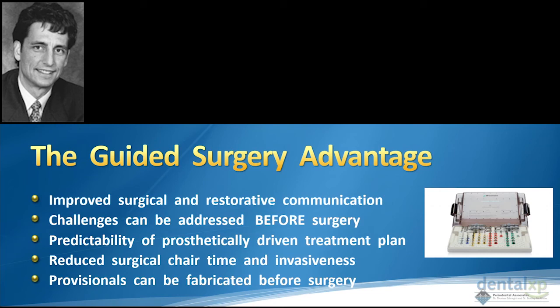We also now have the potential to fabricate provisionals before the surgery because our positioning of these implants is going to be so precise that we can make the provisional, and then all we have to do is some very minor adjustments to the provisionals. That's helped our chair time tremendously because of the length that usually happens when we have to do a provisional.